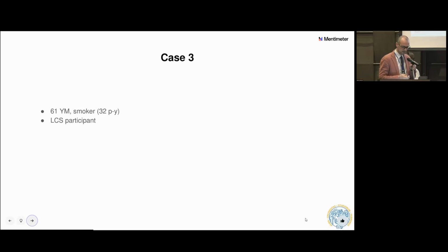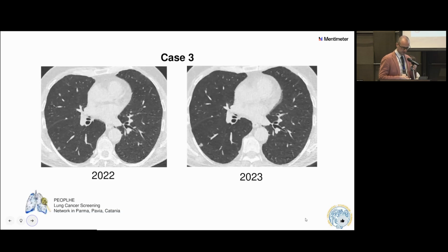Okay, so case number 3, Mario, please. Thank you, Doris. So this case is about a 61-year-old male, a smoker with 32 pack-years, and indeed a lung cancer screening participant in Parma.